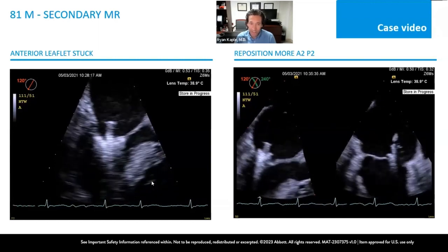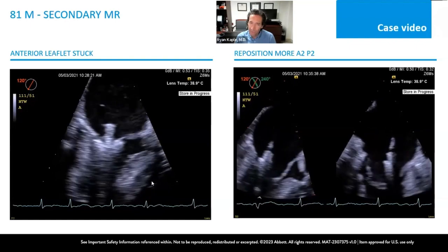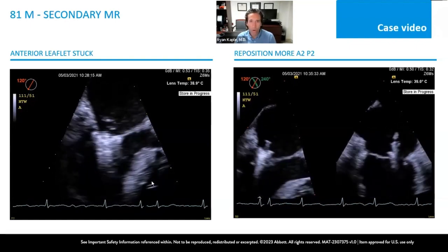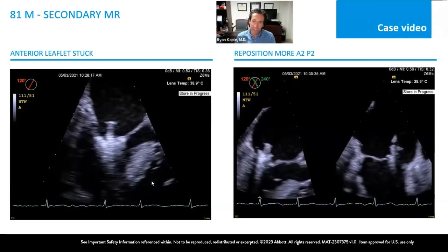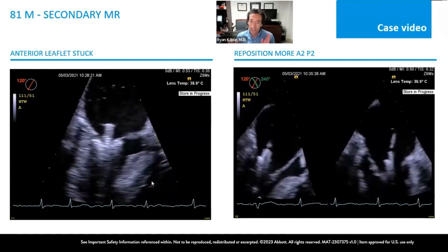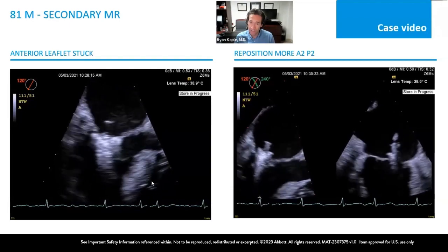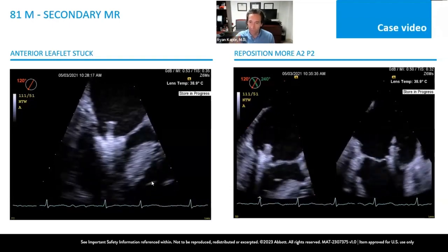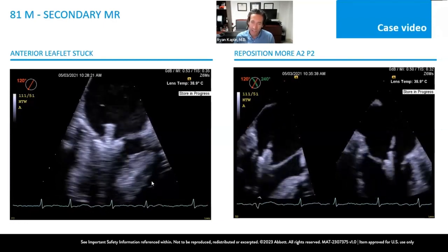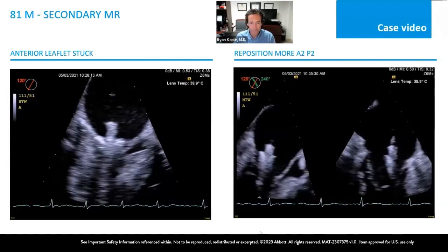One of the things I also wanted to mention when you do get stuck: sometimes, especially in primary cases, a bit of leaflet or cord can come between the shaft and the gripper when the gripper is still raised. It can sometimes be helpful to bring the grippers halfway down on the side where you're stuck, to assess whether you're coming behind the gripper, or how it is interfacing, because it may affect your decision making on how to get unstuck.